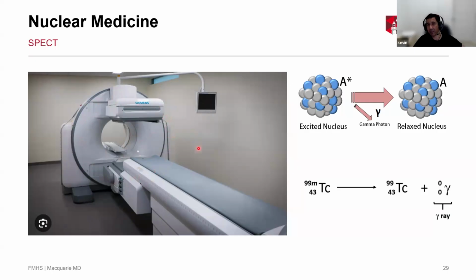Now, nuclear medicine was also called, you interchange the N and the U and you get unclear medicine. It looks very fuzzy. So you need anatomical detail. And so what they've also done is they've actually glued a CT scanner onto it as well. So this contraption at the back also has a CT scanner in it. So not only do we take images of the technetium decay, okay, we're also going to put the patient through the scan, and we can do a CT scan and we can line them all up.